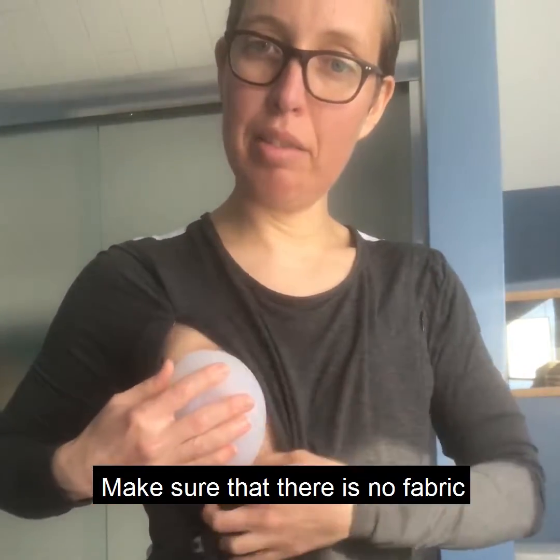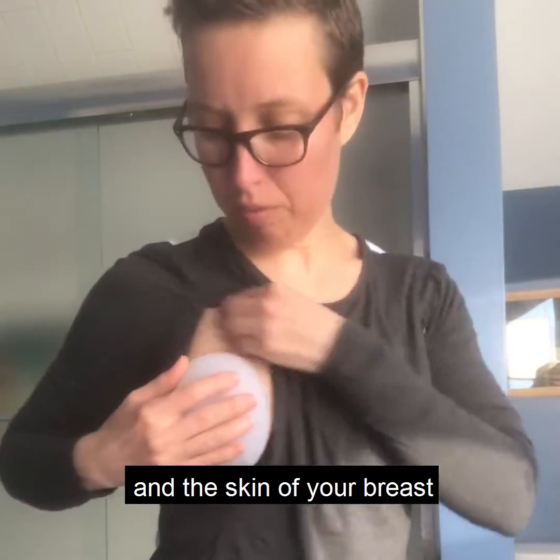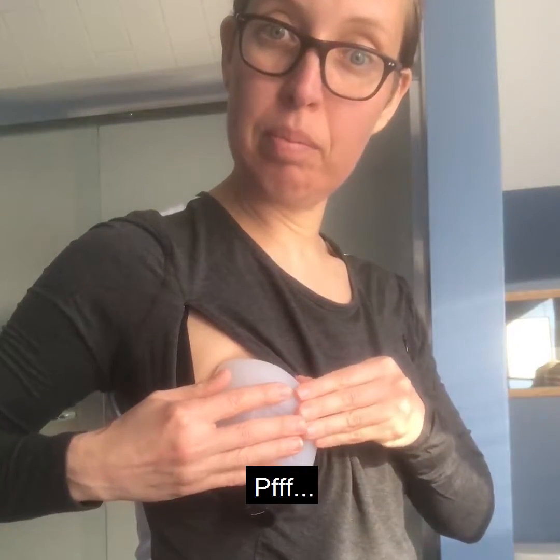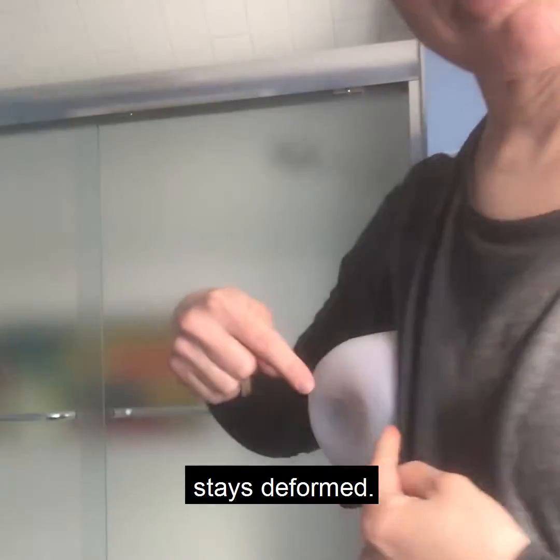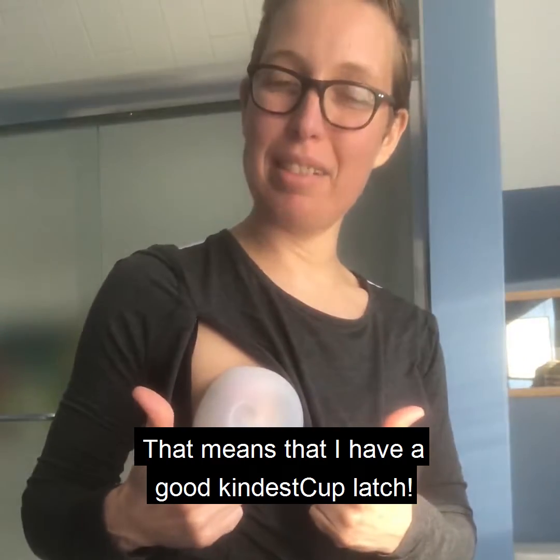Make sure that there's no fabric in between the rim of the cup and the skin of your breast. Next, push the cup against your chest and listen for the sound. Notice how the shape of the cup stays deformed. That means that I have a good kindestCup latch.